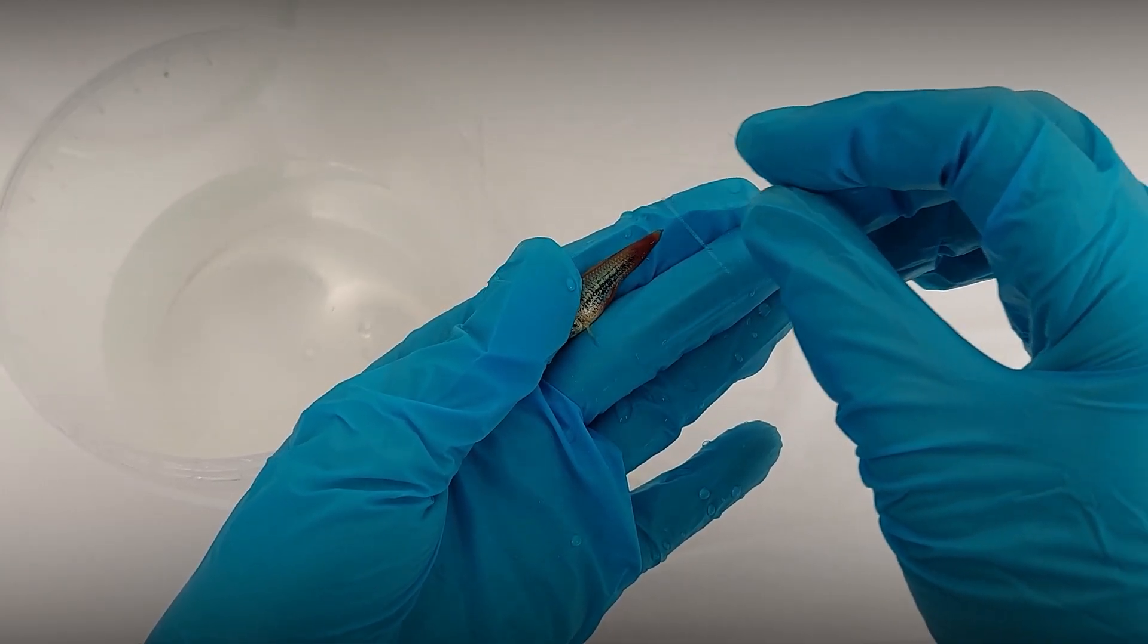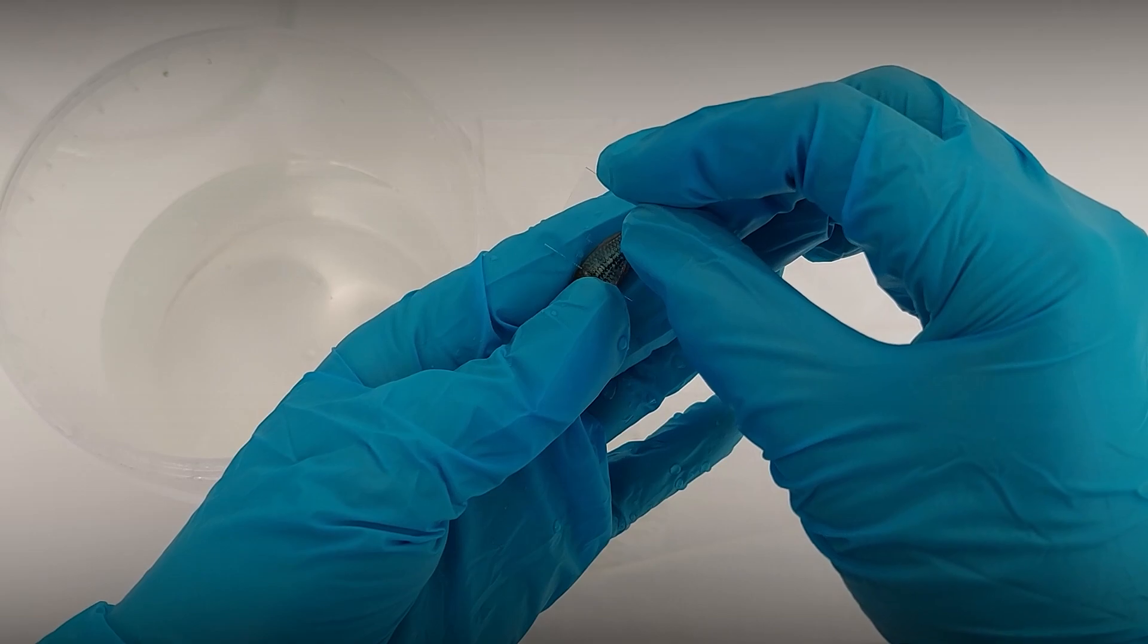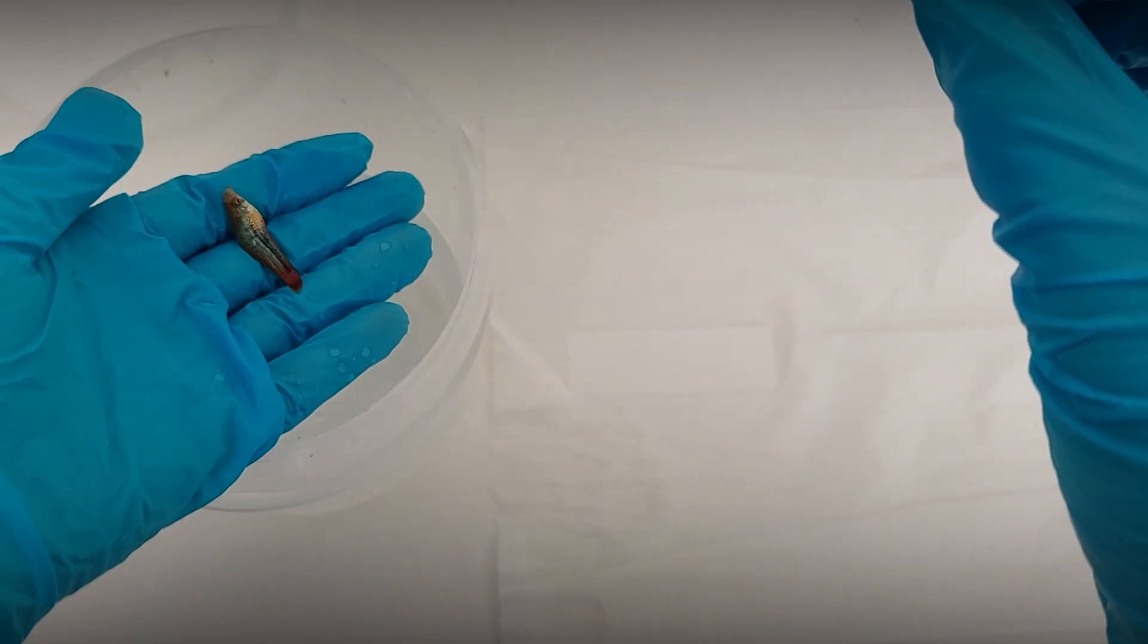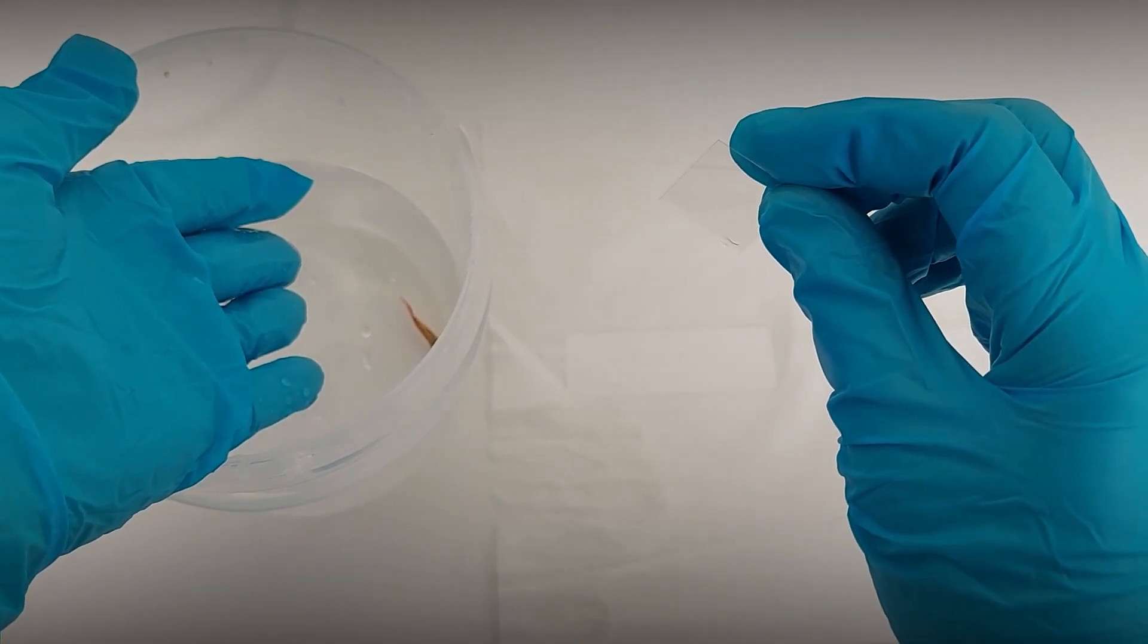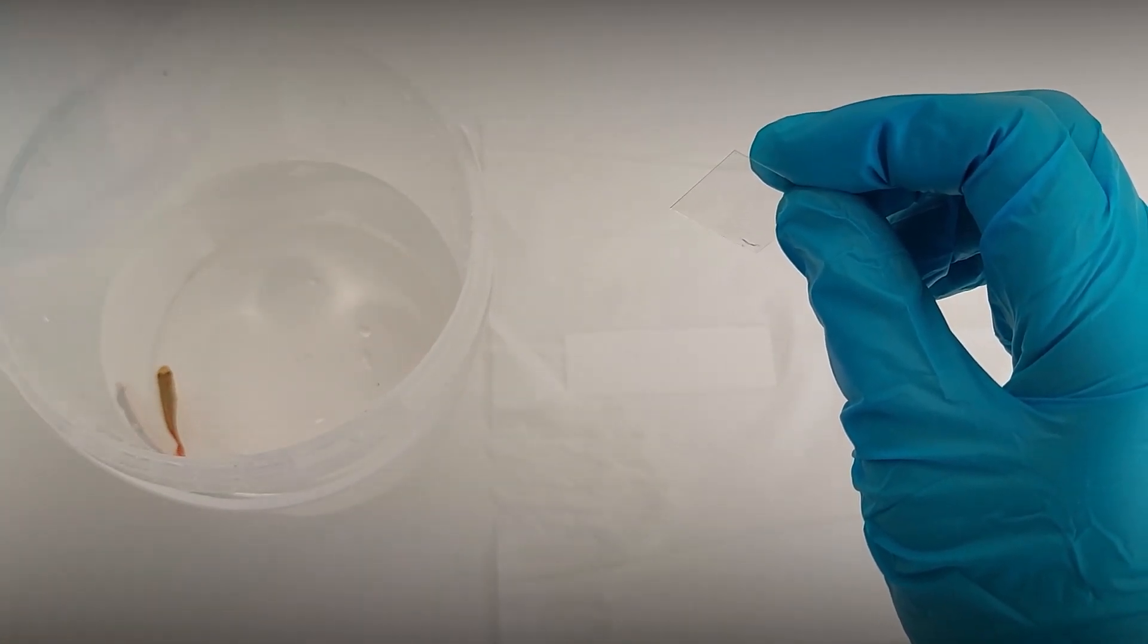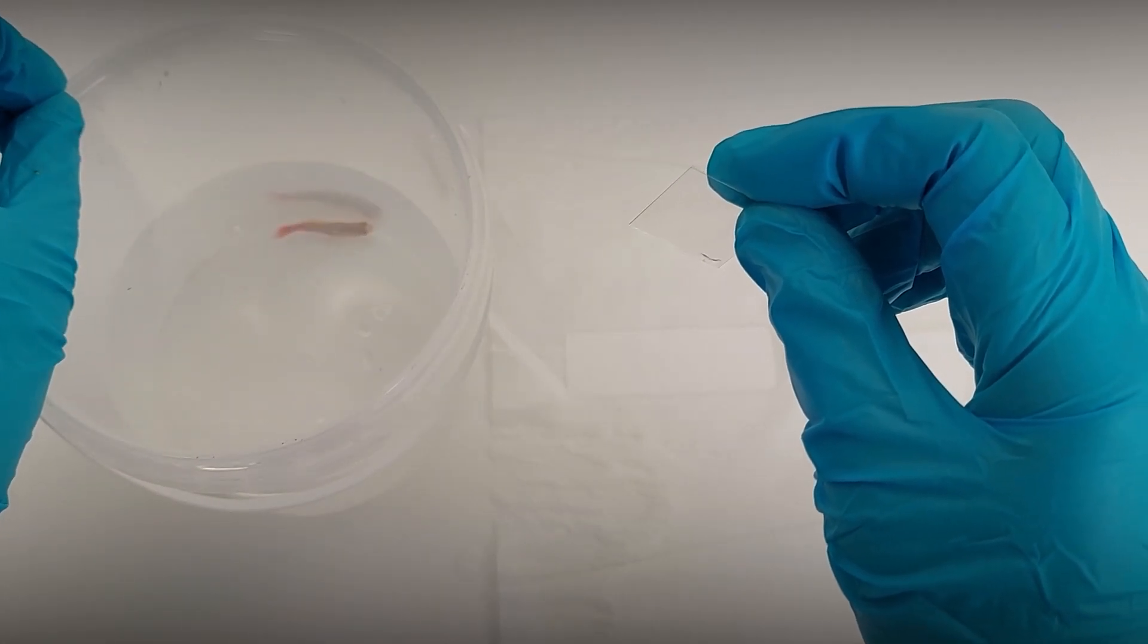Hold the cover glass or other tool at a 45 degree angle. Without pressing hard, move the slide along the body of the fish from head to tail. If you use the same pressure as when writing with a pencil, you will not hurt the fish.